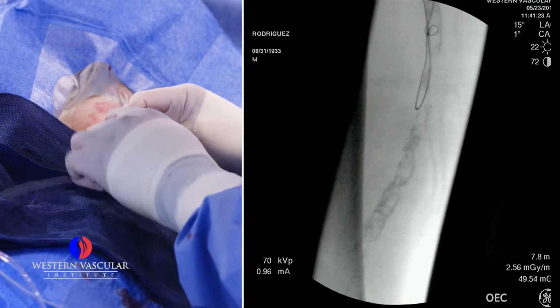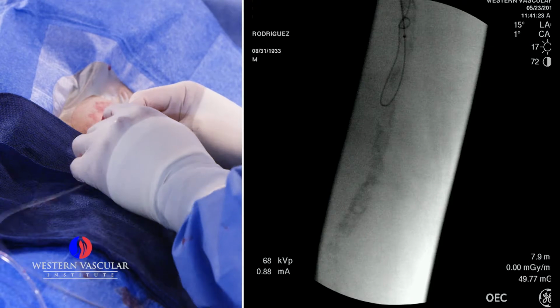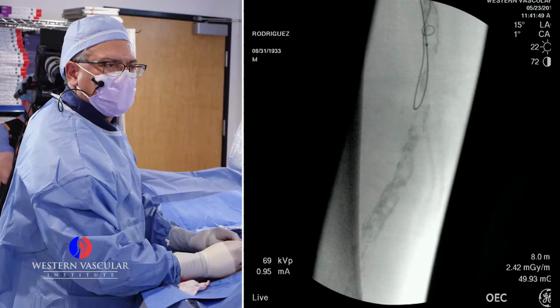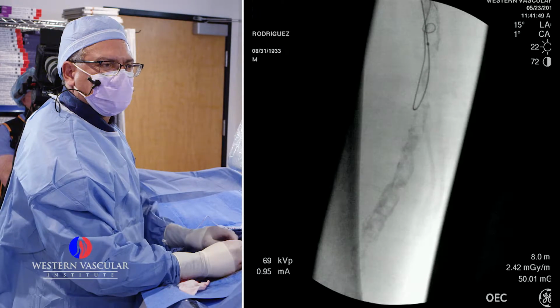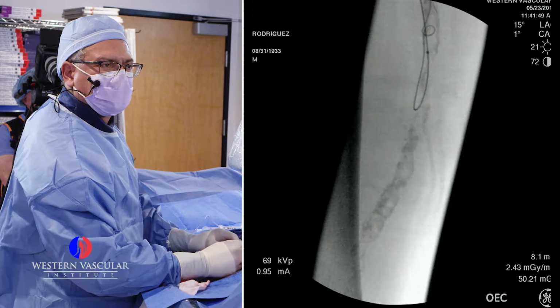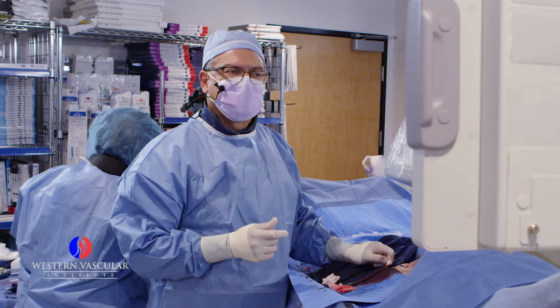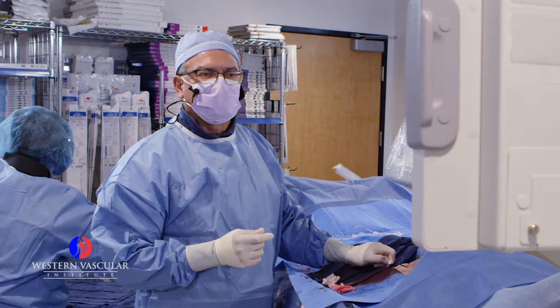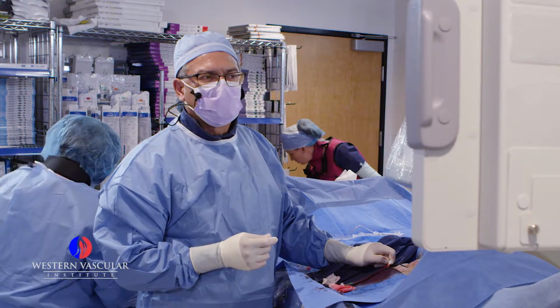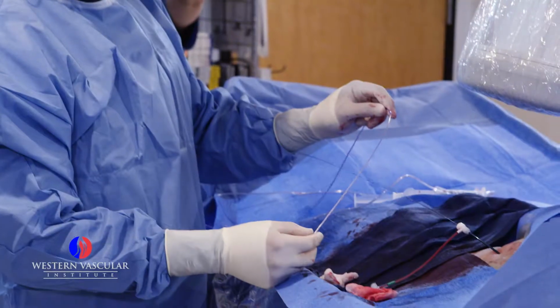So I'm going very slowly because of the tightness of the blockage. You can see the little dot at the end of the catheter moving forward. And I know from the previous angiogram that there's flow just getting close to the edge of the bone right there. Because I feel the resistance to advance the catheter, what I will do is get a balloon and start dilating the channel of the blockage, and hopefully I can move further down with less restriction.